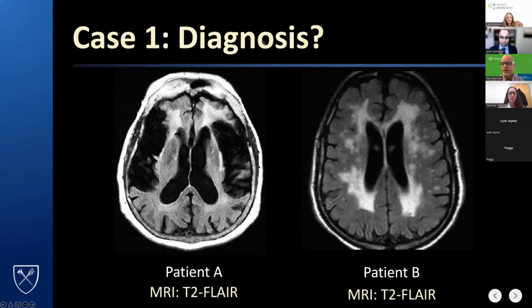We have a vascular dementia. You have a nod about vascular dementia. Any other answers? Mixed dementia. Sure. Okay. Good. I think that's a great start here.